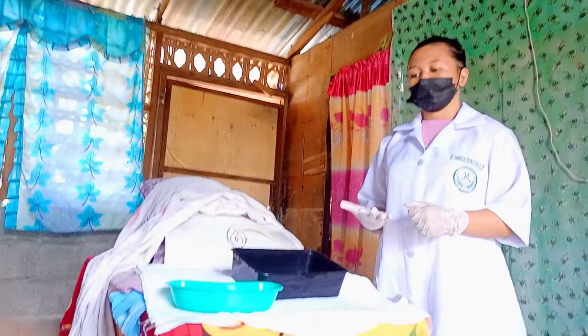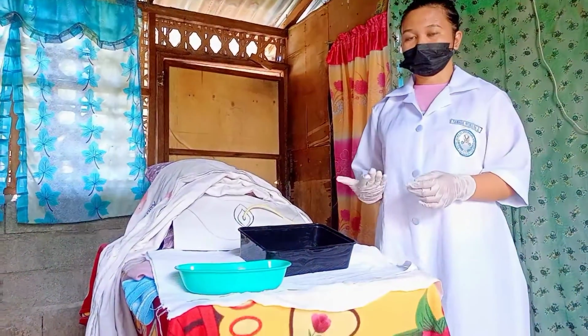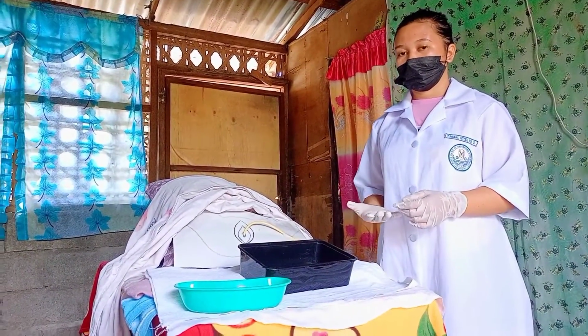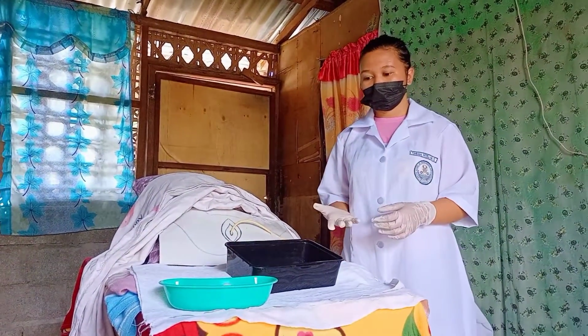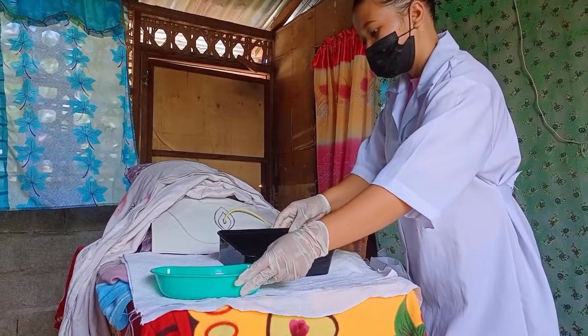And also remove gloves and place the patient in a comfortable position. Also remove all the equipment and do aftercare. Wash your hands to prevent transmission of microorganisms.